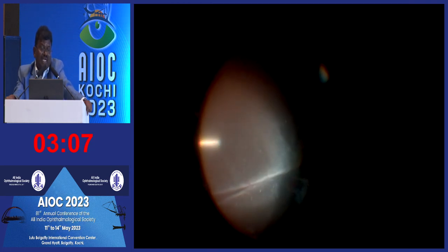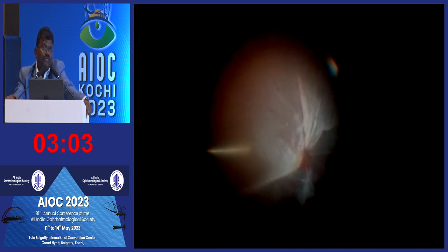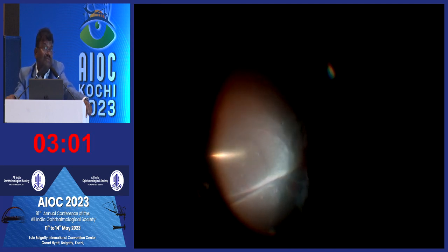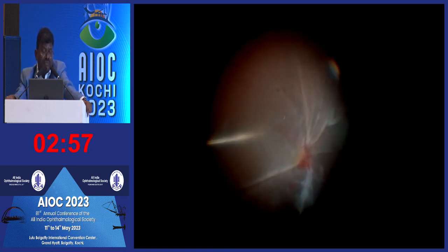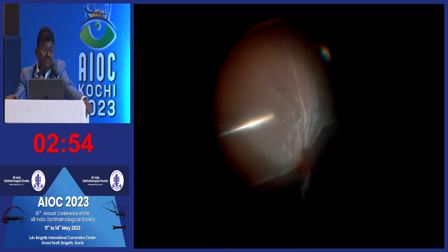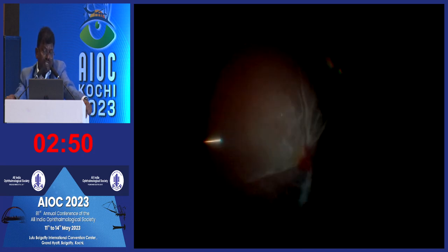In this case, I am now inserting the flute needle in the same space. I want to drain the fluid without making the retinotomy. So this is another advantage which we have started doing now. So I have used a chandelier light also. So this is the flute needle under the retina to drain the subretinal fluid.